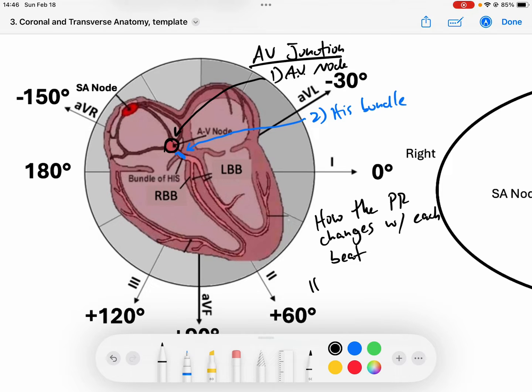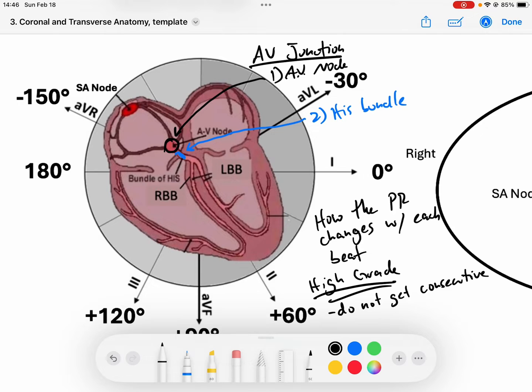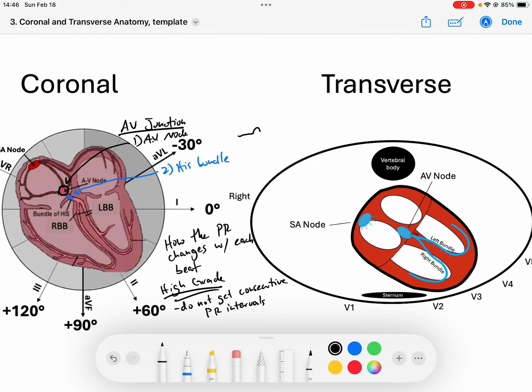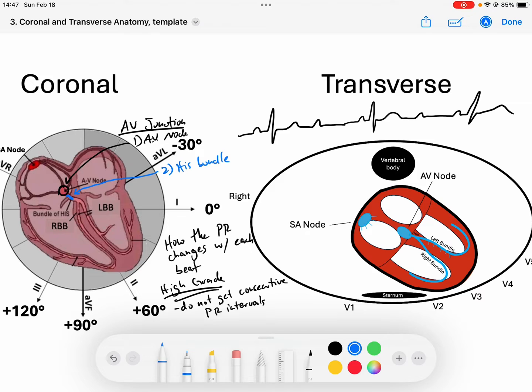The issue with a high grade block is that we do not get consecutive PR intervals. Because essentially we only get one P to QRS complex, and then we get some drops. So what it looks like is a P wave conducts to a QRS and a T wave, then another P wave doesn't conduct, then a P wave conducts, then another P wave doesn't conduct. We cannot determine whether the PR interval is changing or not.